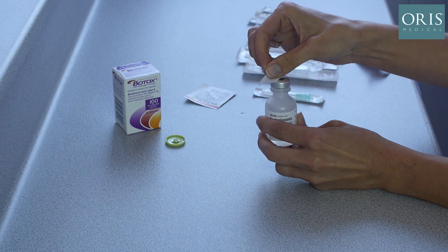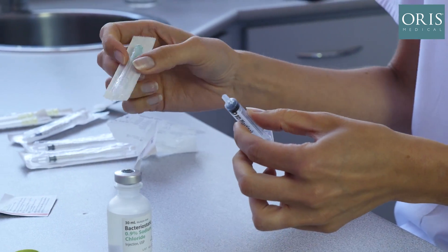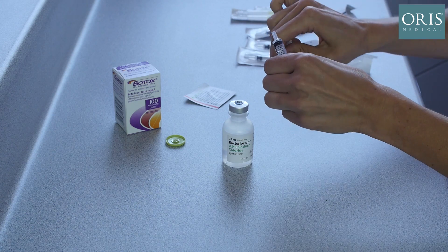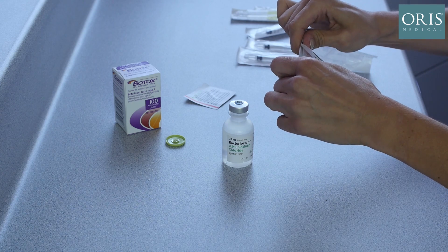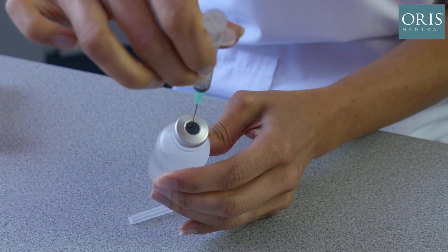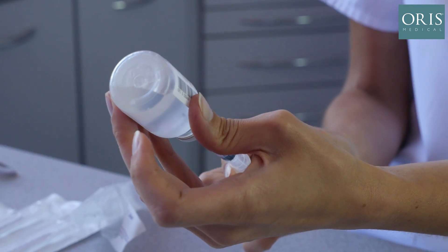Using an alcohol wipe, we remove the cap of the bacteriostatic saline and clean the stopper. We then take the 2.5 ml syringe and 21 gauge green needle. The cap is removed and inserted into the grey rubber stopper of the bacteriostatic saline. This is turned upside down, we ensure the tip of the needle is immersed in the saline and begin to draw up 2.5 ml of bacteriostatic saline.